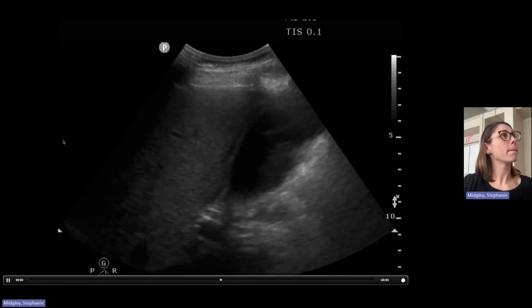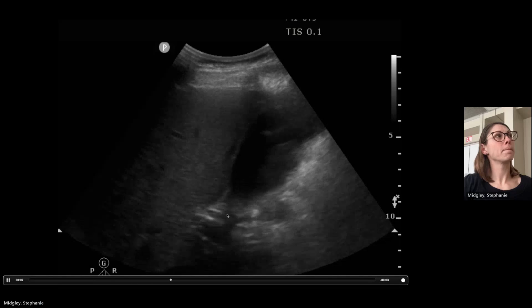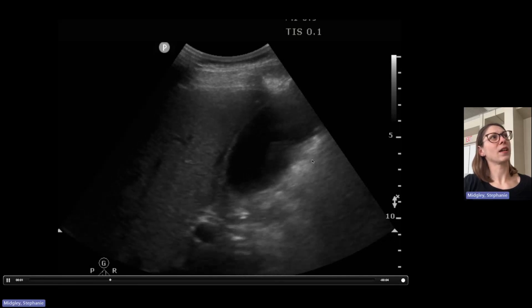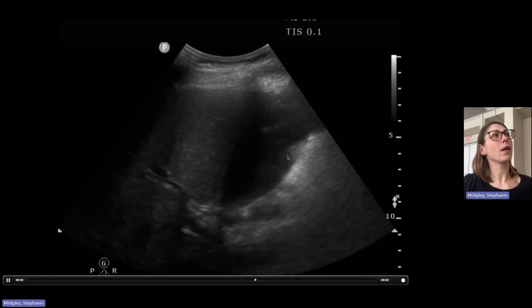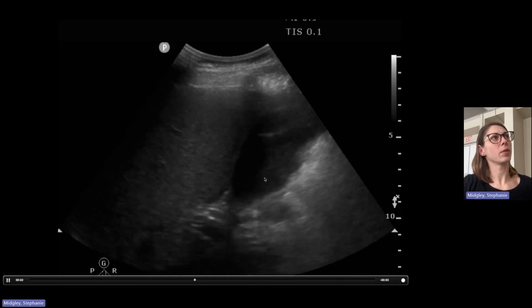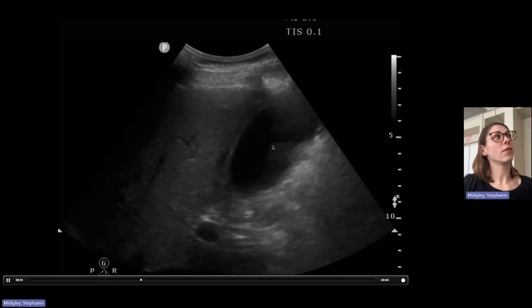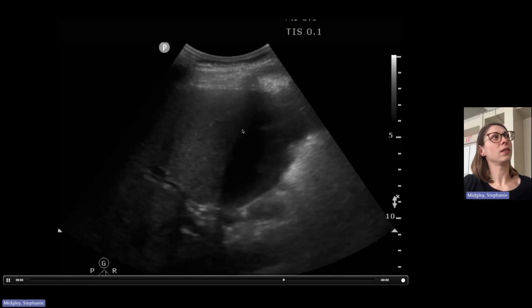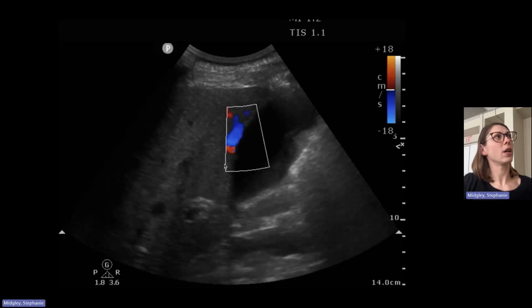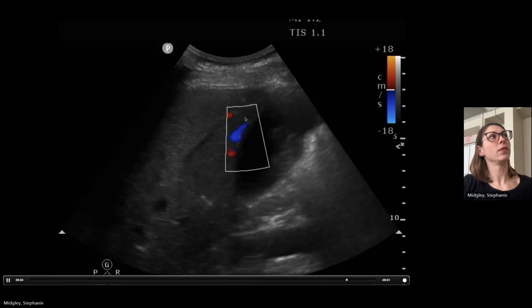Is there a little bit of free fluid around the anterior wall, with the posterior wall? It's like a little hazy. It's just like there's something there. This is what we call side lobe artifact. People smarter than me can explain it, but this is actually a fake out. This is a hepatic vein that's tracking right along the gallbladder. And so what can help you figure it out, again, is color flow. So you can see there's flow within there.